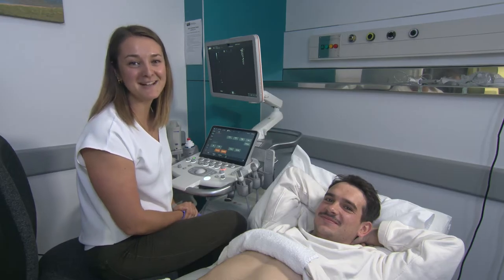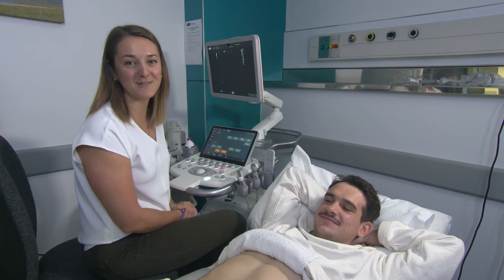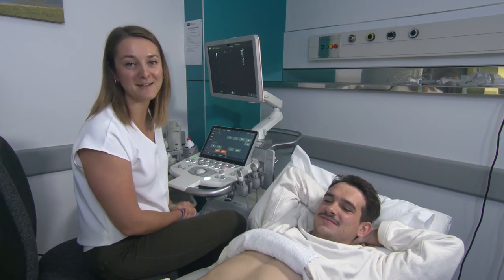Hi everyone, my name is Adriana and I'm one of the sonographers at the University of Auckland. Today we're going to be learning about how to scan the pancreas.